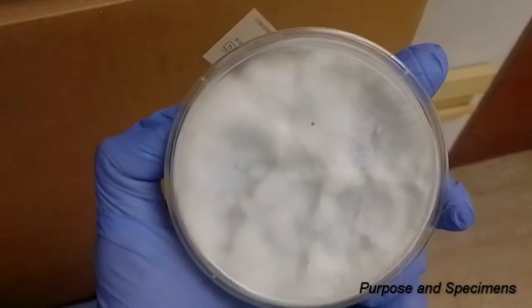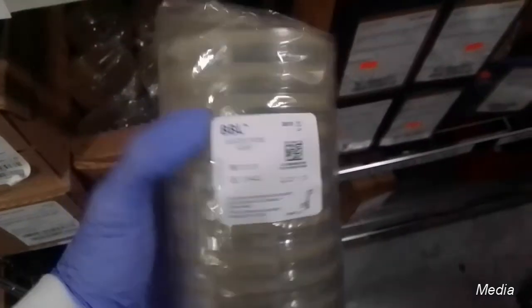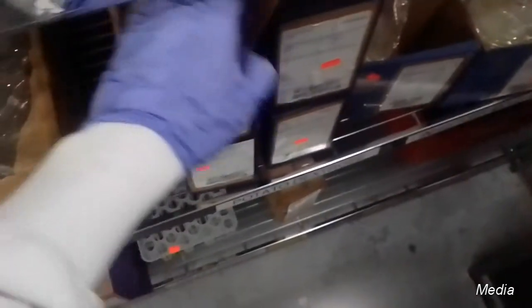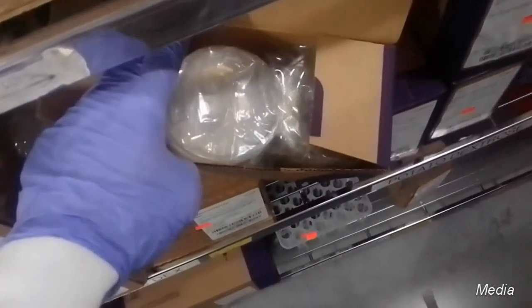When it comes to media for doing a fungal culture, it is a requirement to have one selective and one non-selective plate at a minimum. In the lab we actually use two of each, so we have four plates in total. Some of your non-selective plates would be something like a SAB plate or PD, or potato dextrose as it is also called. These plates would grow pretty much everything — bacteria as well as your fungi.